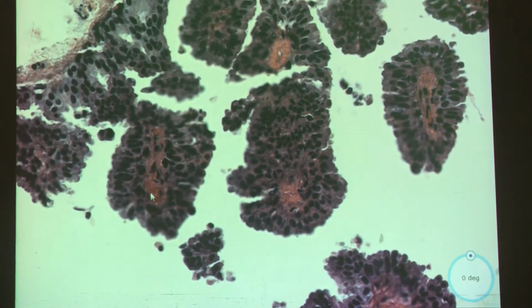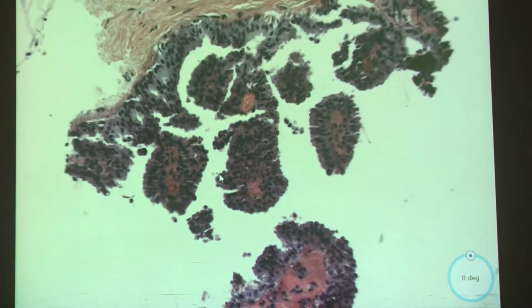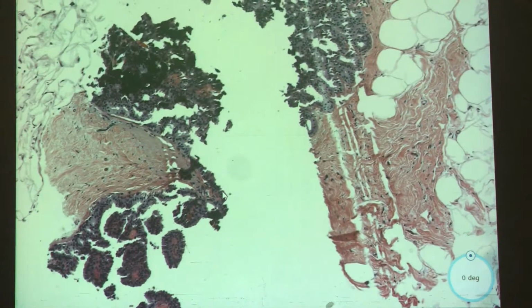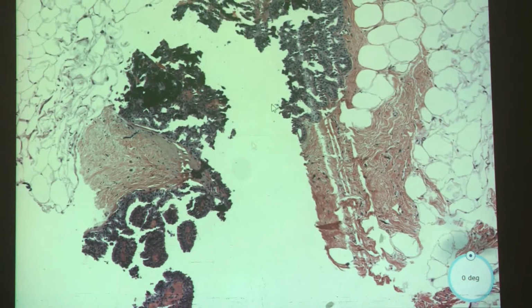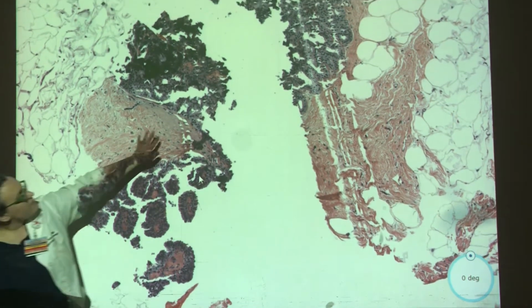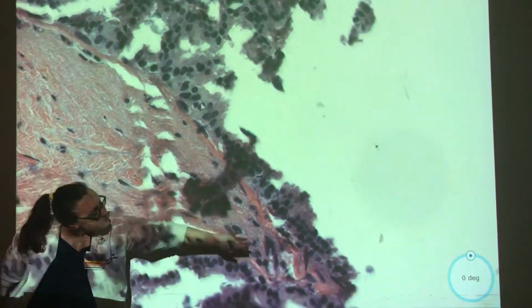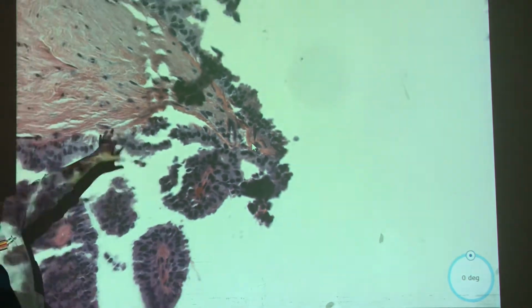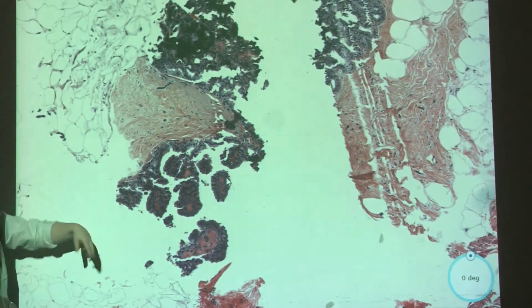Yeah, a little easier to see at lower power. This area looks more like a papillomatous configuration. Perfect. So, are these two separate lesions? I think they look like one lesion because you have this area up here, and it kind of wraps around here, where you can imagine maybe this is a frond sticking down, and then it comes into this stuff here that's kind of falling away.